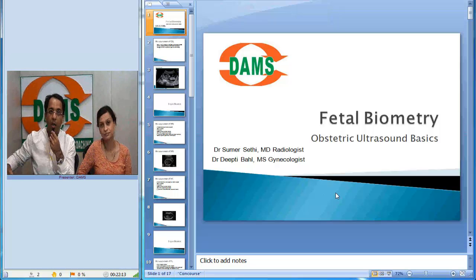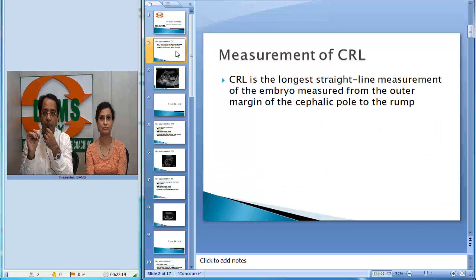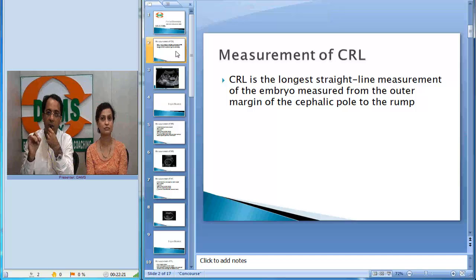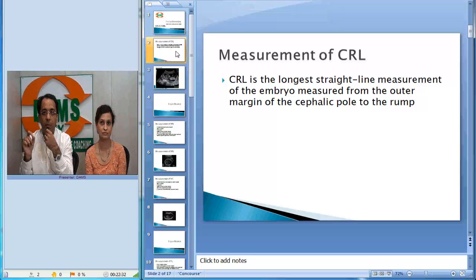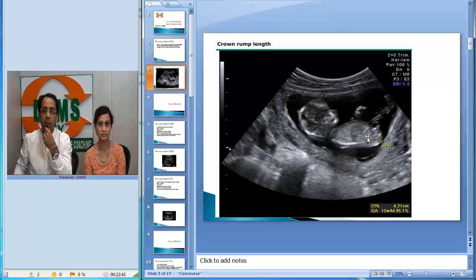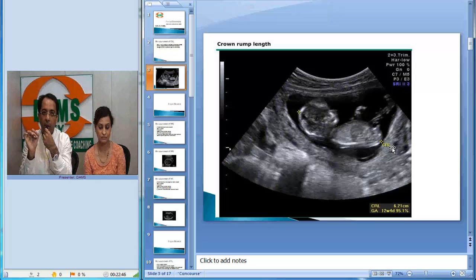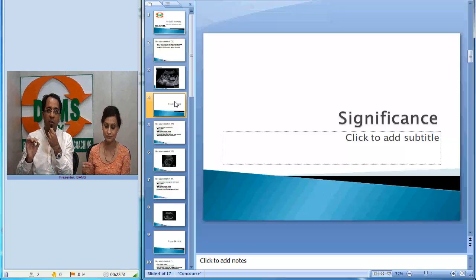The first parameter important for early fetal biometry is CRL — Crown Rump Length. This is measured as the longest straight line measurement of the embryo from the outer margin of the cephalic pole to the rump of the embryo. You place one cursor point at the crown and draw a straight line to the rump. This is a very important early pregnancy biometric marker.